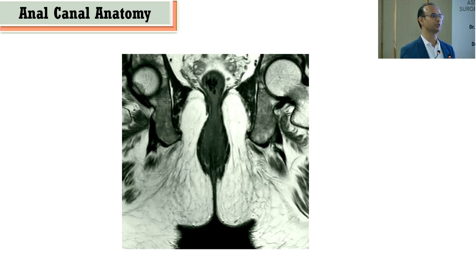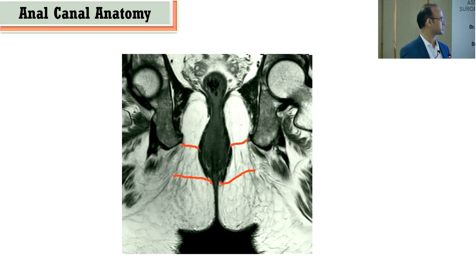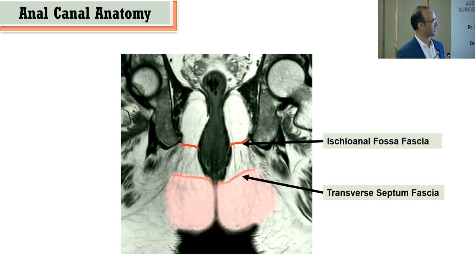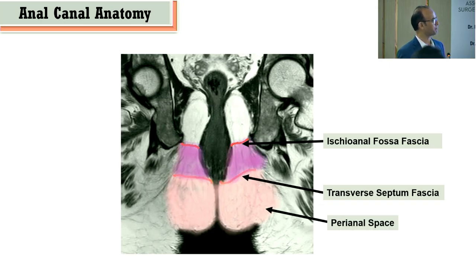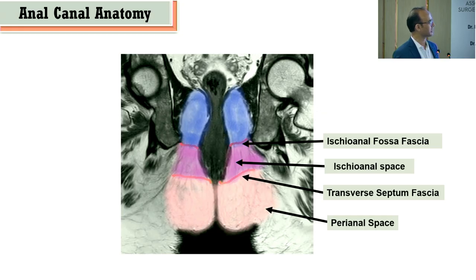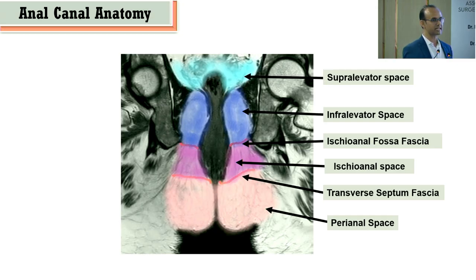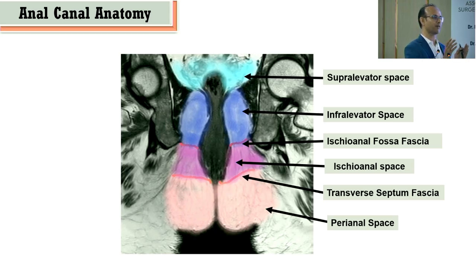After identifying the sphincter, we examine the surrounding spaces. A transverse fascia septum and ischiorectal fossa fascia divide the spaces: the lower is perianal, the second is ischiorectal space, above is infra-levator, and above the levator on coronal view is the supra-levator space. These four lateral spaces, combined with identifying internal and external sphincters, allow us to find most pathology and plan treatment — even for abscess cases on the operating table.